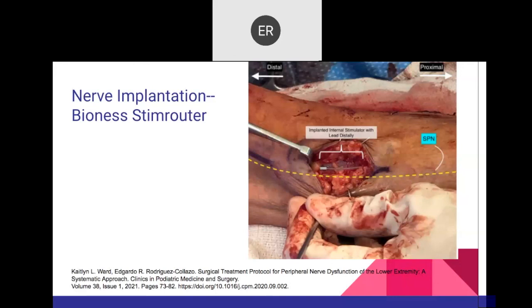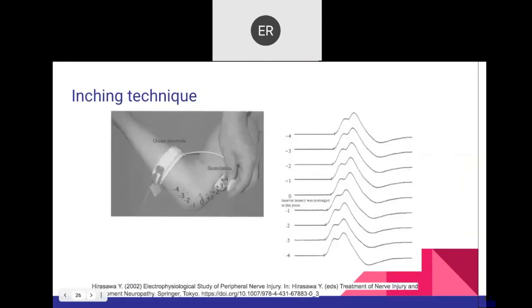The lead is placed just adjacent to the identified nerve. In a case with a superficial peroneal nerve, the nerve is suprafascial or subcutaneous, and the lead is placed just adjacent to it — very simple to do and can provide significant relief for compromised patients. The device does not need to be removed, though in severely compromised areas it can scar and fibrose over time, losing some effectiveness — another reason to place it in a healthy area above the damage.